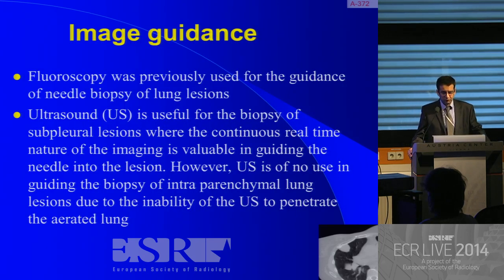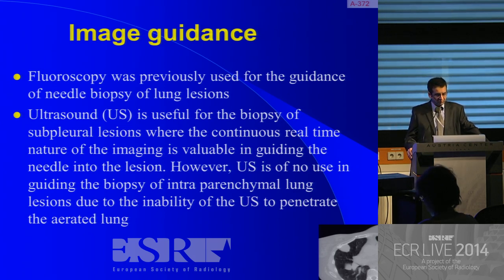Fluoroscopy was previously used for guidance of needle biopsy, and all of us in the past did most of our biopsies under fluoroscopy. You could do AP and lateral approaches, and they're very good. But CT now has become, especially for the smaller size lesions, much more important. Ultrasound, as the chairman had shown you, is also useful for the biopsy of subpleural lesions, and also where you want continuous real-time imaging. But it's not good at all for biopsying an intraparenchymal lung lesion, because ultrasound cannot penetrate the aerated lung as well.